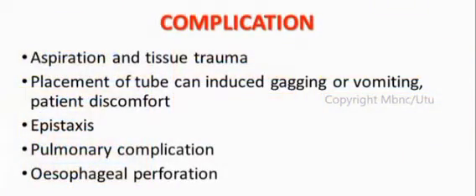Complications: aspiration and tissue trauma. Placement of the tube can induce gagging or vomiting, patient discomfort, epistaxis, pulmonary complications, and esophageal perforation.